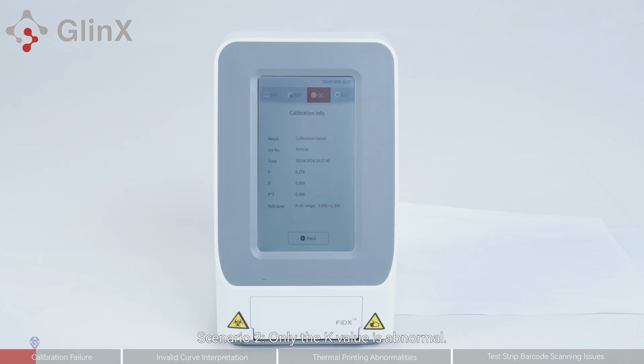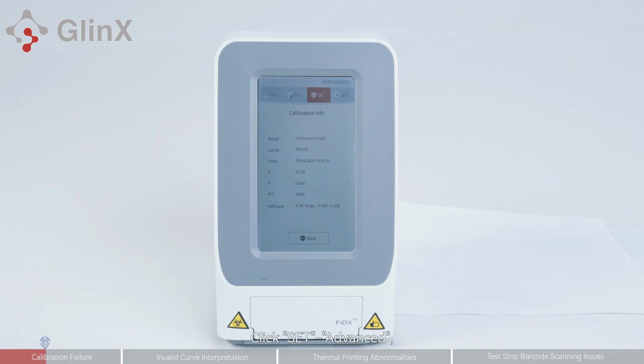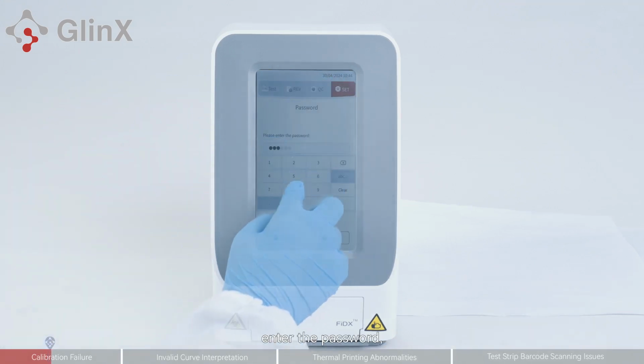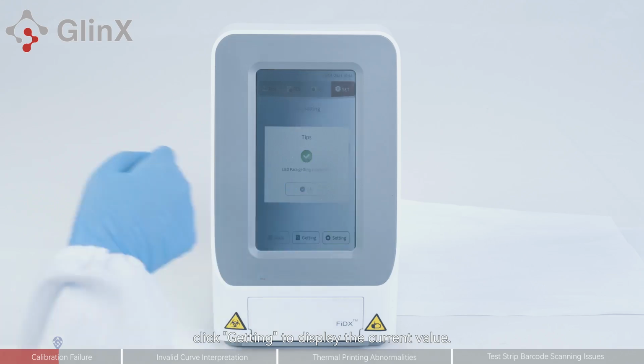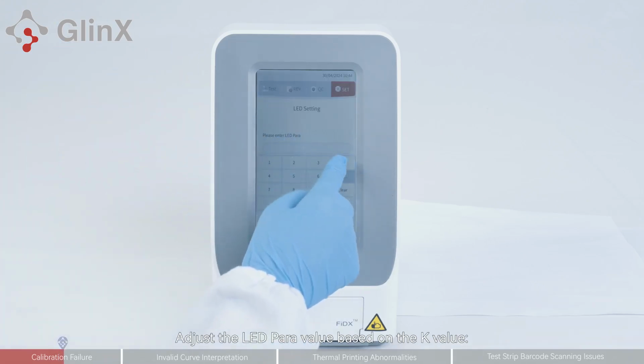Scenario 2. Only the K value is abnormal. When the K value is out of range, the LED para value current needs adjustment. Here's how. Click Set, Advanced. Enter the password. Then click LED Setting. Before adjusting the current, click Getting to display the current value. Adjust the LED para value based on the K value.